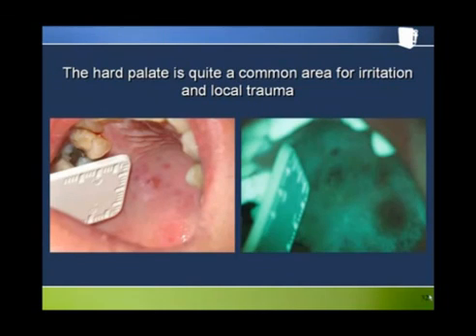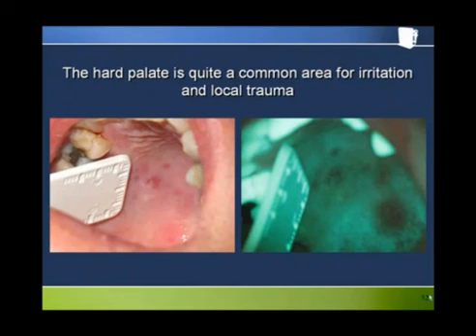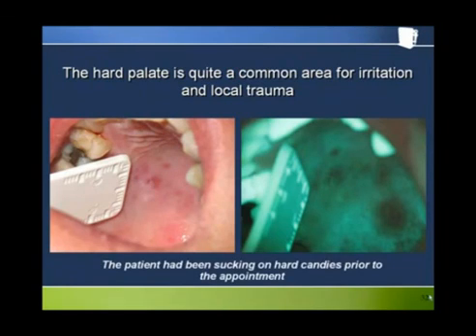This is an example on the hard palate of inflammation, quite a common area for irritation and local trauma. The dark areas under Velscope correspond to the irritated and sore looking areas under white light. As it turns out, the patient had been sucking on hard candies before coming to the dentist.